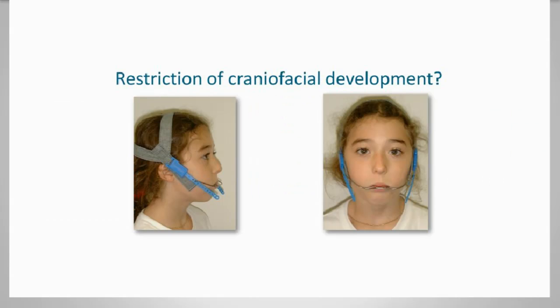questioning restrictive mechanics that we do on patients, such as headgear. Headgear works great at fixing occlusions when you're just looking at teeth, but it's kind of backward to think about why we would want to restrict forward growth of the jaws when you think about airways, particularly on somebody who we can screen for that has a small airway to begin with. Certain treatment plans and mechanics really are contraindicated with patients that have small airways.